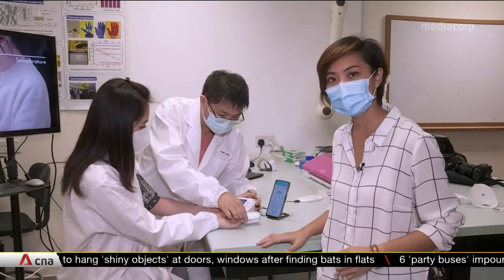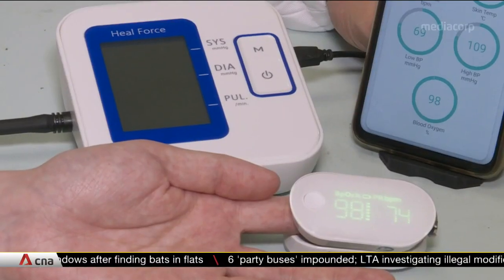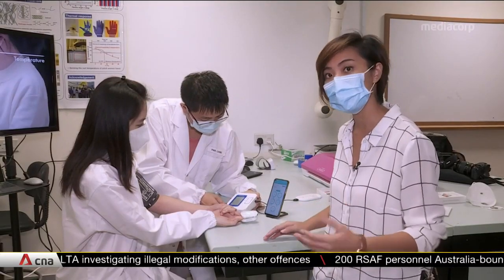That's not the conventional way of tracking these signs. So to ensure accuracy, the team is tracking results from the actual monitors as well as the masks simultaneously, and that's showing a marginal difference of about one to three percent.